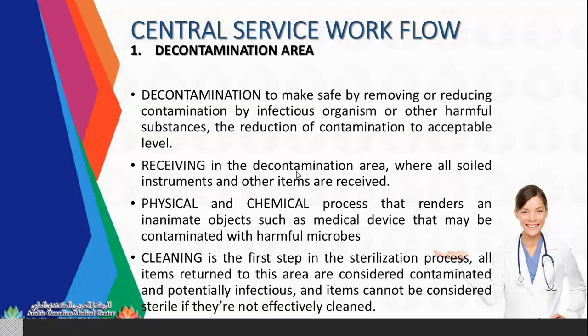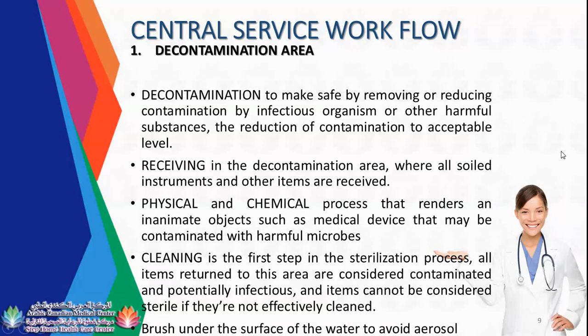In the decontamination area, guys, the aim is to make items safe by removing or reducing contamination by infectious organisms or harmful substances, the reduction of contamination to an acceptable level. It is either by manual brushing and then mechanical cleaning or ultrasonic machine cleaning. Receiving in the decontamination area is where all soiled instruments and other items are received. It is a physical and chemical process that renders an inanimate object, such as a medical device, that may be contaminated with harmful microbes, safe. Cleaning is the first step in the sterilization process.